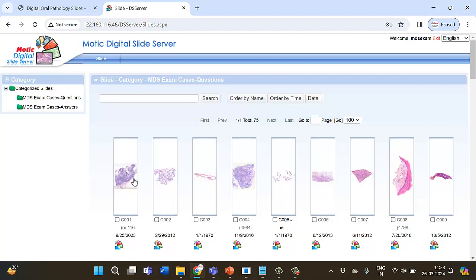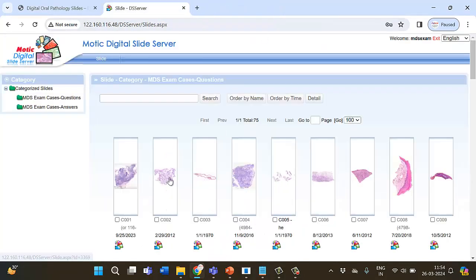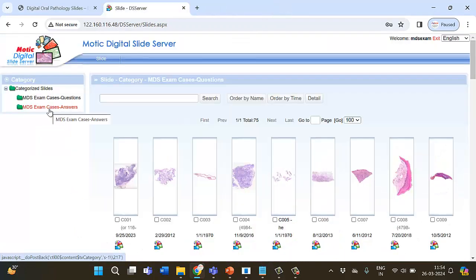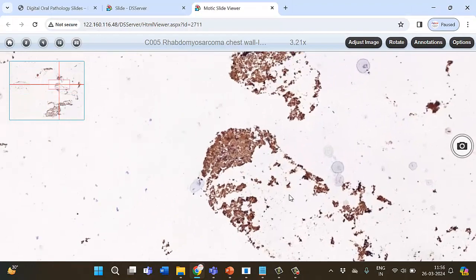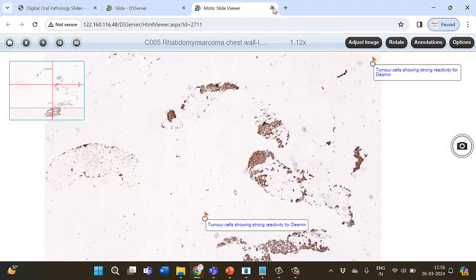Each slide has been given a unique number like C001, C002, C003 and so on. A digital image of every case is provided with pertinent clinical history, and the viewer is supposed to make the diagnosis. Here is an example of the clinical history of a case.